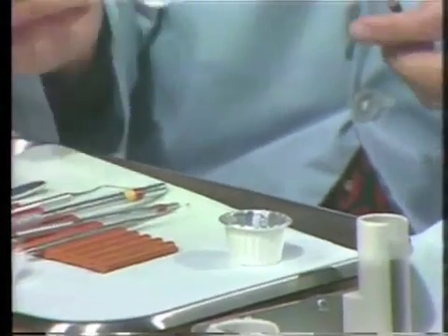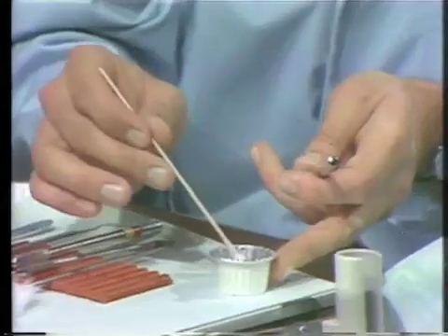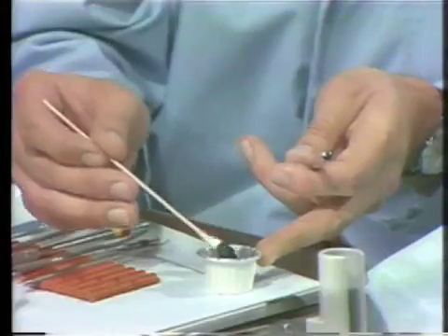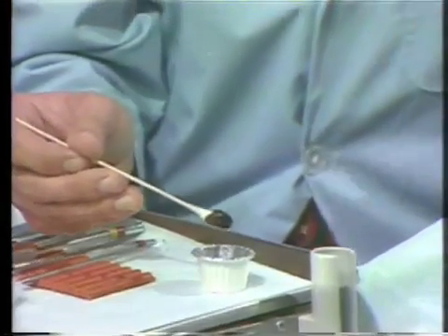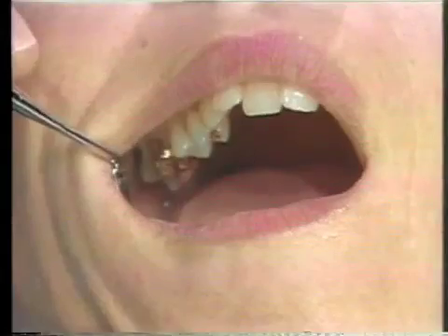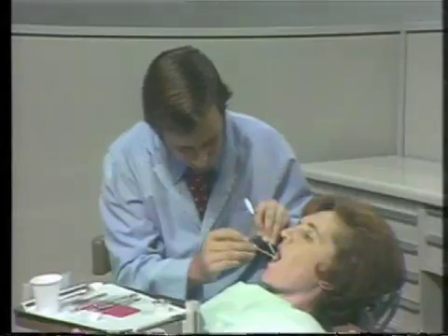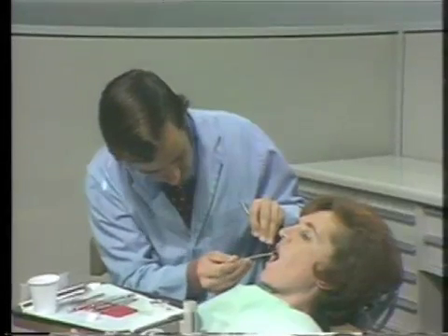Take a cotton swab and dip it into the disclosing solution, getting a liberal amount of solution on the swab. Be careful that you do not spill any of the solution on the patient's clothing because the stain will not come out. Then move to the mouth and retract the lip and cheek with the mirror. Take the disclosing solution and more or less flood it on all of the teeth so that both the interproximal and the buccal and labial areas of the teeth are covered. This may take a number of applications. If all the surfaces are not covered, all the plaque will not be disclosed.